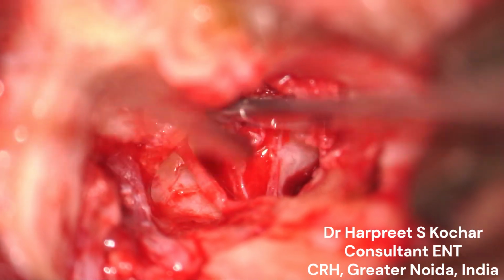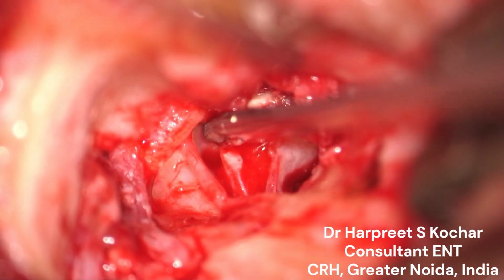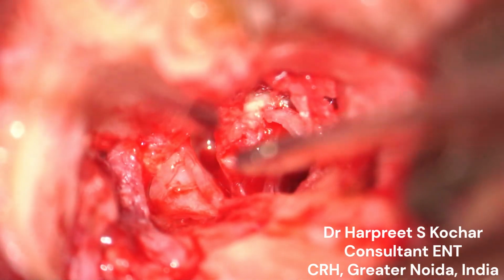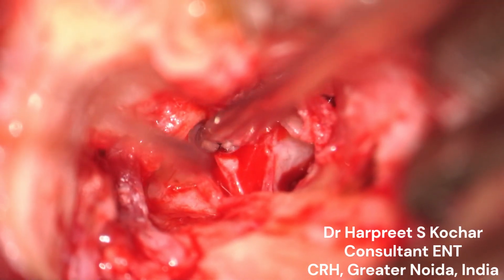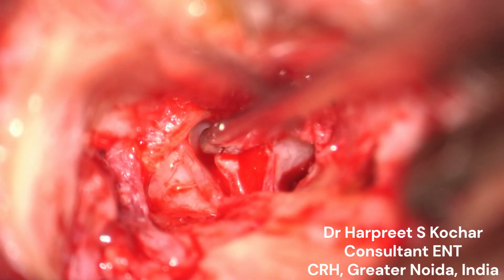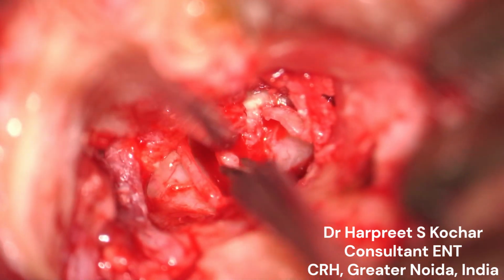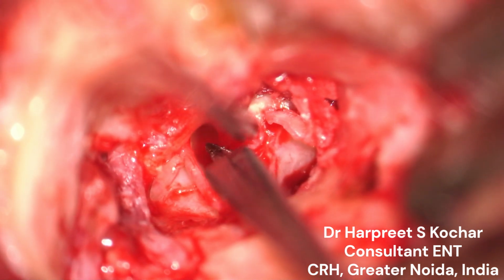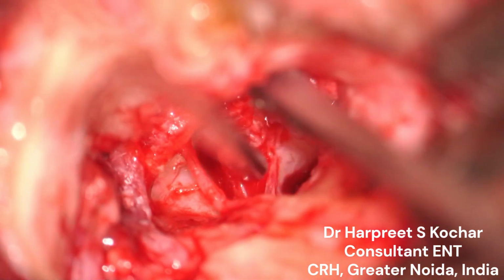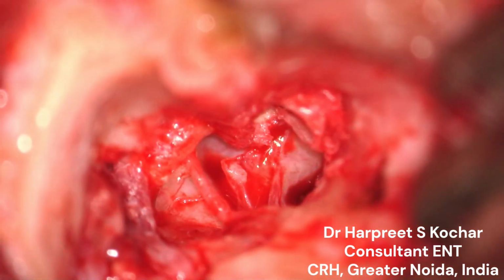And at a certain point of time, it would seem that that is the maximum effort that can be applied, and there are certain dense fibrous adhesions which cannot be easily peeled off. So these thick, firm dissections can be cut off with micro scissors, and the disease is now completely removed.